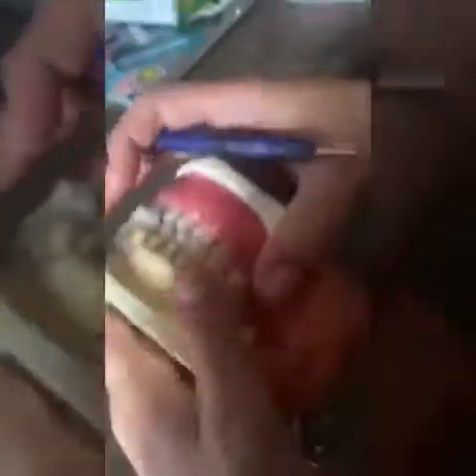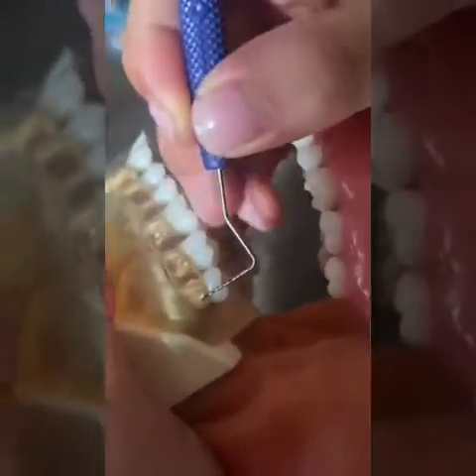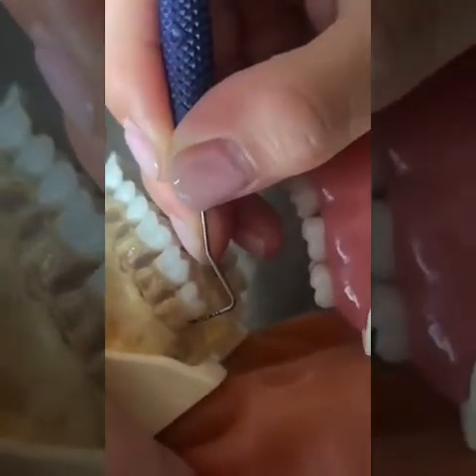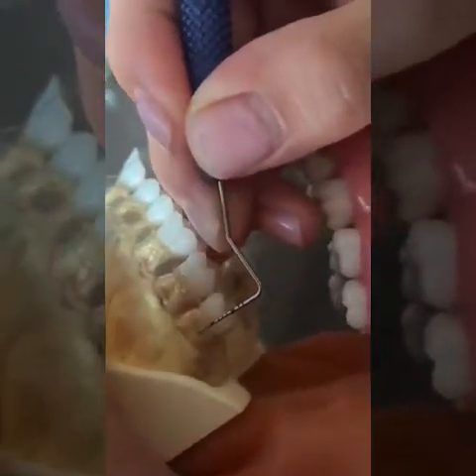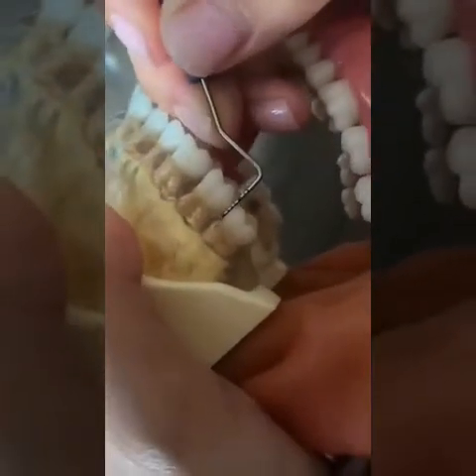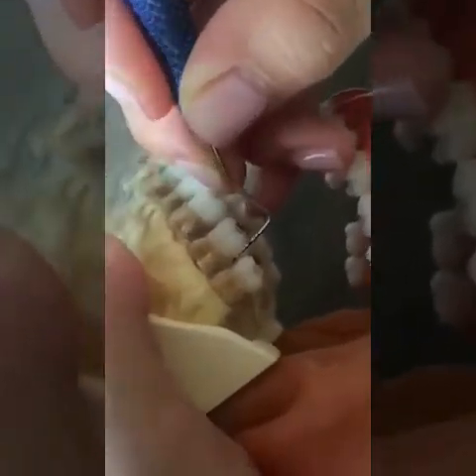We're going to go from number 1. So we're going to insert our probe into the distal line angle. We're going to walk to the interproximal area. We're going to tilt 10 degrees and record. We're going to remove the instrument and put it in the distal line angle. We're going to walk to the mesial line angle. We record the deepest reading, and then again we're going to walk into the interproximal area mesially, tilt the instrument 10 degrees and record. We remove the instrument.